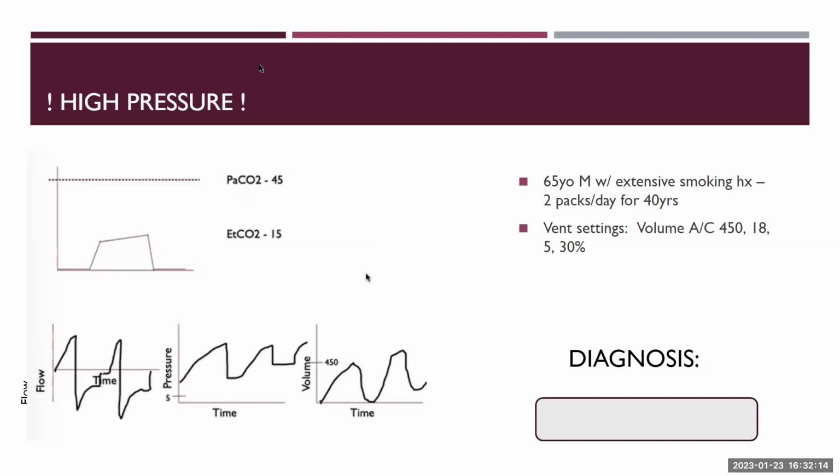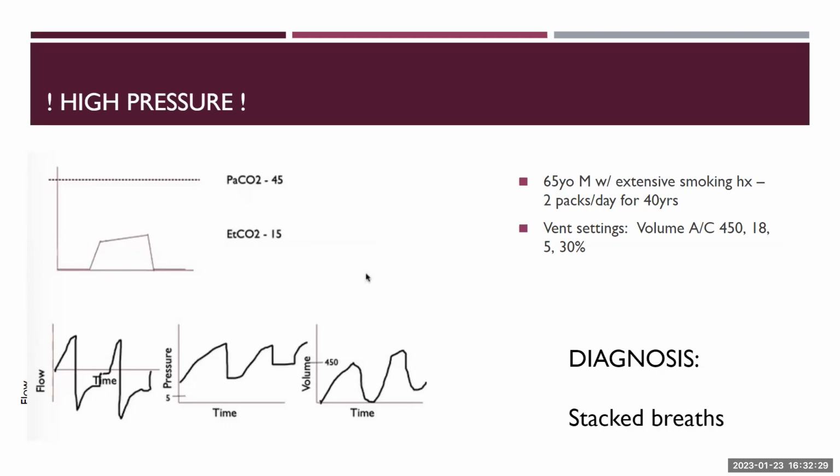You're almost there. So they're building up volume. There's something going on where this patient is not getting out as much air as they're taking in. So the breaths are getting stacked. You were right there. I think you were just waiting for what word to actually diagnose this with.